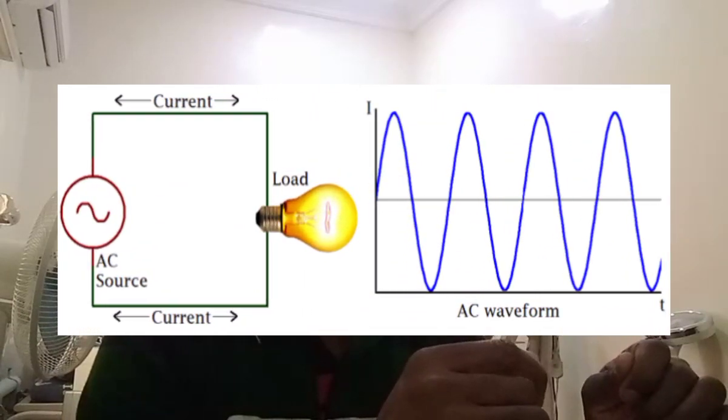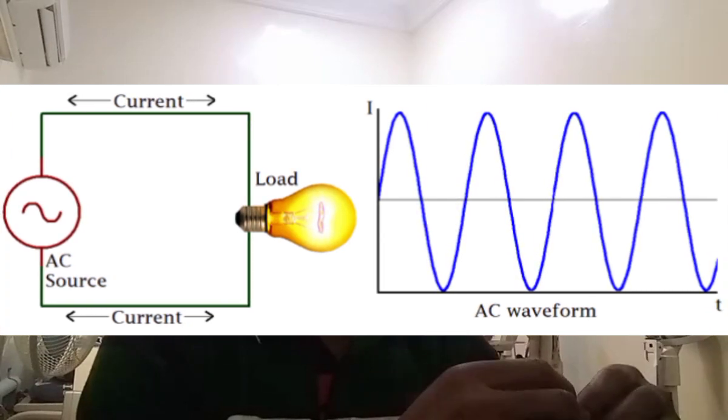A stronger excitation voltage produces a stronger ultrasound pulse, which will penetrate further into the tissue. Now, manufacturers use alternating current, AC current, as excitation voltage, which has a known frequency. So by changing the frequency of the excitation voltage, this transducer's ultrasound frequency can be changed without changing the transducer.